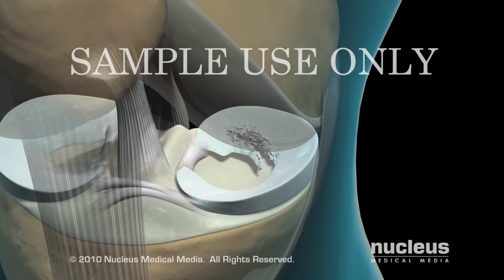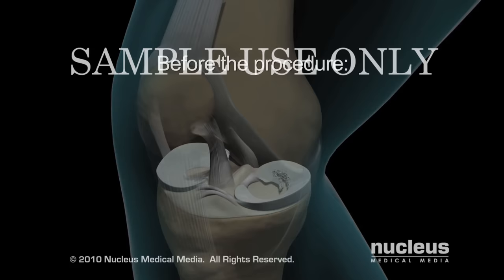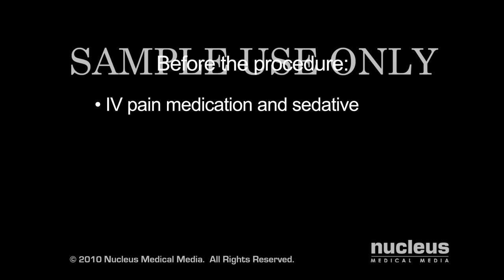Knee arthroscopy is often performed to remove the damaged portion of the meniscus. When you arrive at the hospital for your procedure, an intravenous line will be started and you may be given a sedative to help you relax.